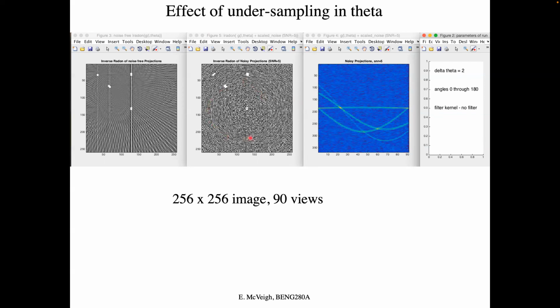The image itself looks quite different. The streaks are more closely packed, which makes sense. And it seems like the image is more accurate in certain areas, where the streaks are actually canceling things out more accurately.